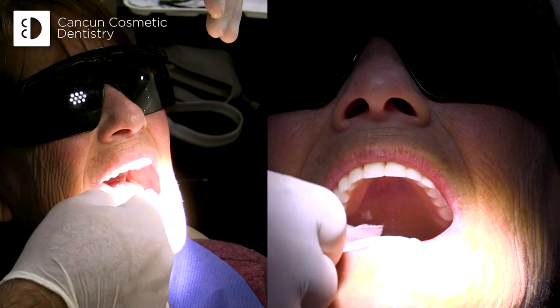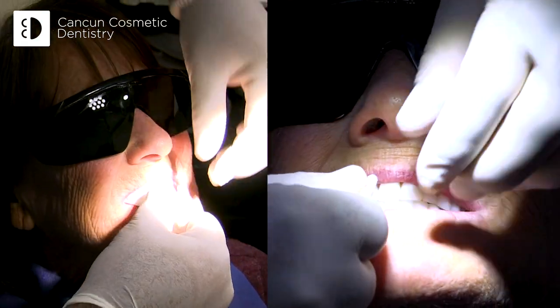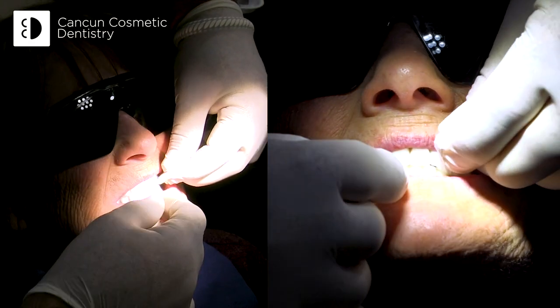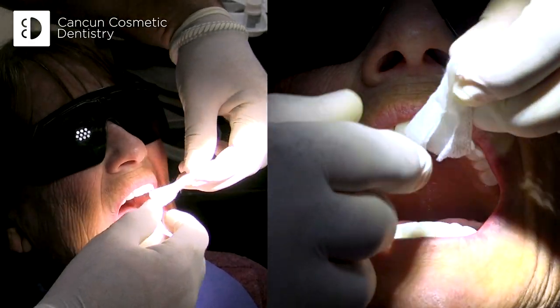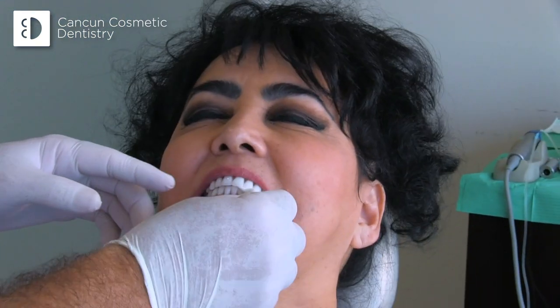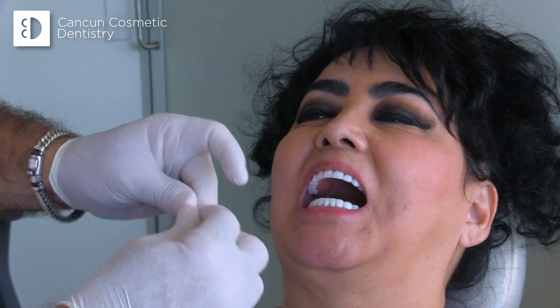Let's take a look. See how strong they are? Uppers — strong. Lowers — strong. They won't wiggle. They're strong. They're anchoring over different implants.